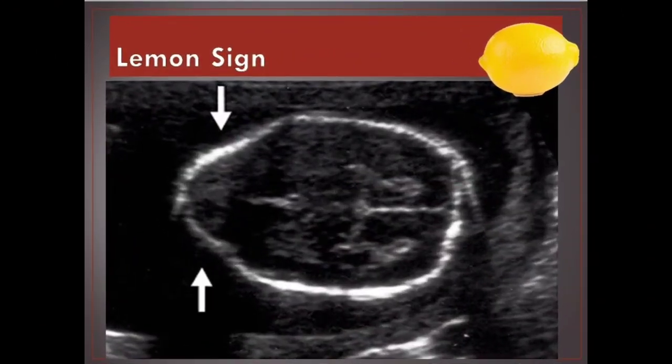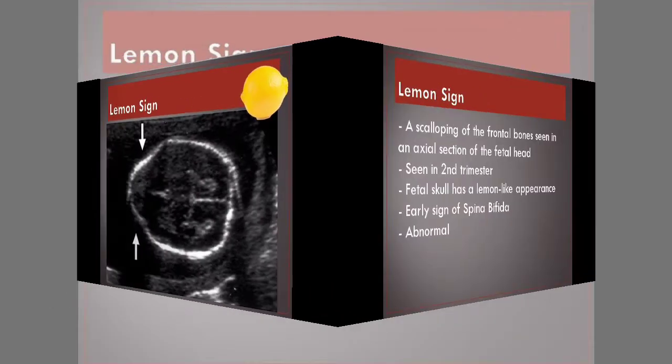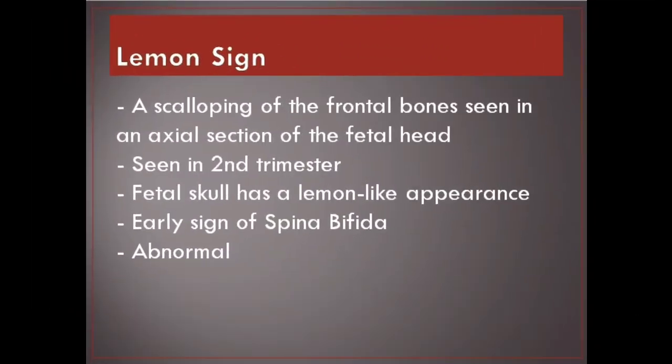Lemon sign. A scalloping of the frontal bones seen in an axial section of the fetal head. Seen in the second trimester, the fetal skull has a lemon-like appearance. This is an early sign of spina bifida. Abnormal.